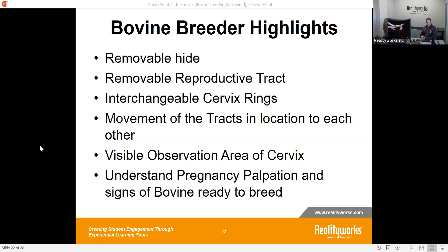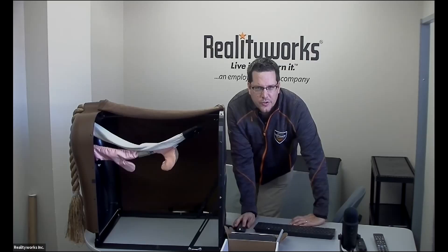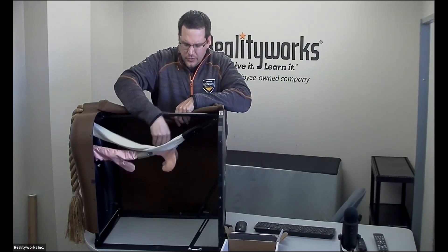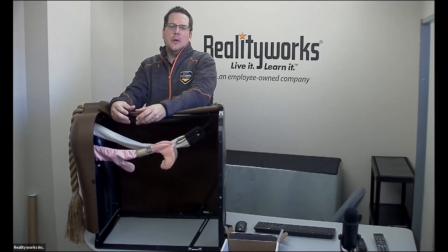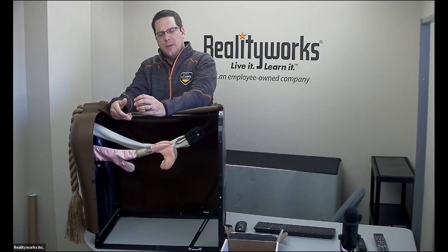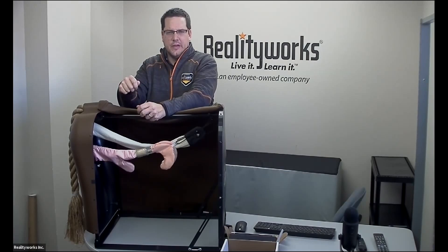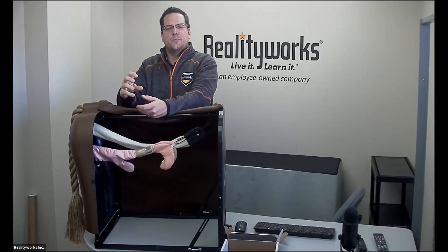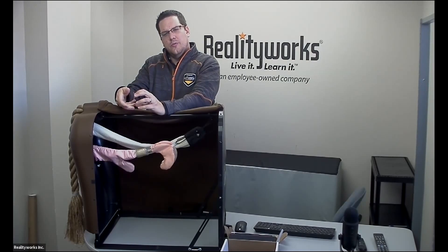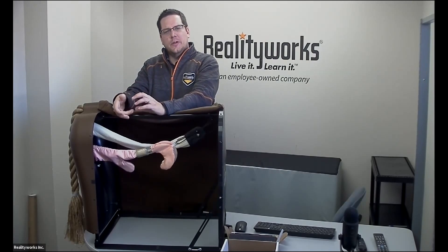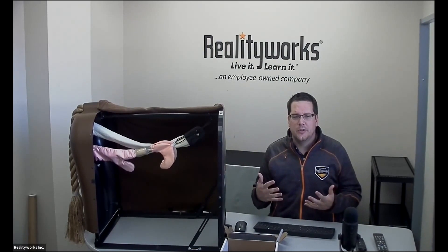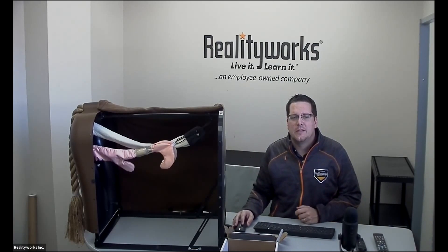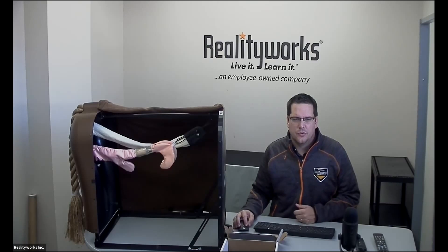It has interchangeable cervix rings. Inside the cervix, there are three different rings in a small compartment that you can move. By moving those rings, you change the difficulty level of maneuvering through the cervix. Turn them one way and it's easier; turn them another way and it's more difficult. This allows students to start at an easy level and progress to greater difficulty as they get better at artificial insemination.